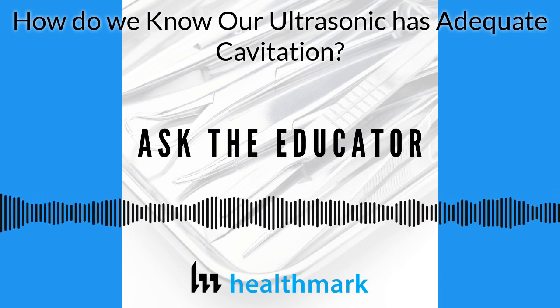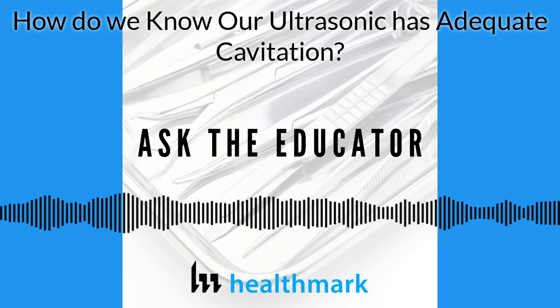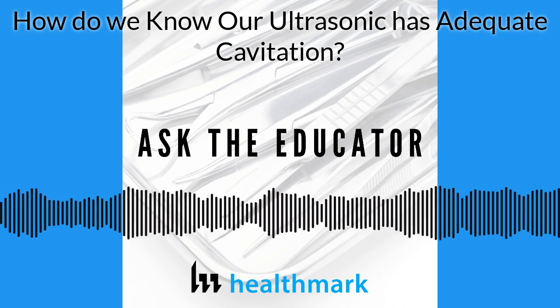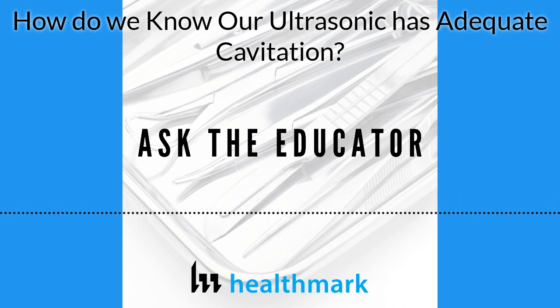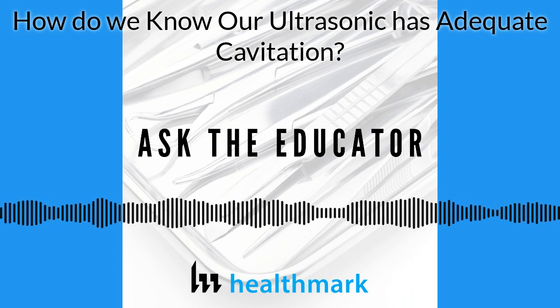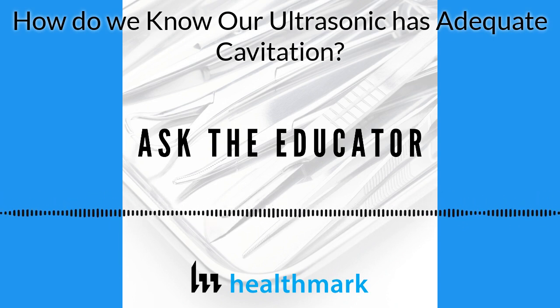Okay, Kevin, to get into that definition, I think we should set the table and say, here in the U.S., we follow ANSI/AAMI ST79. And within that document, they have a section on ultrasonic cleaning. It states that depending on the type of sonic cleaner you have, you should perform tests each day the sonic is used.